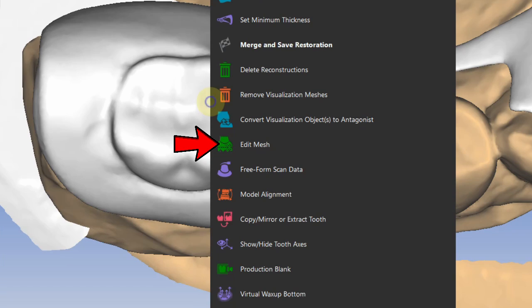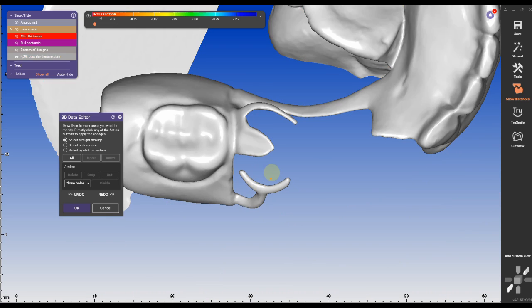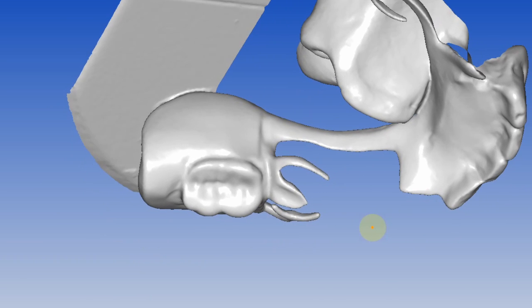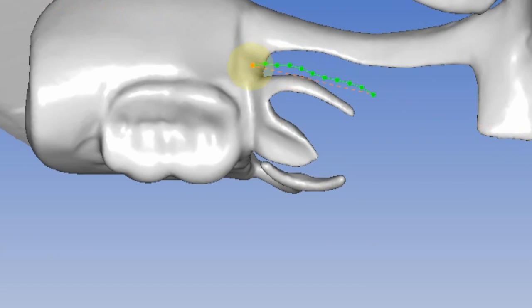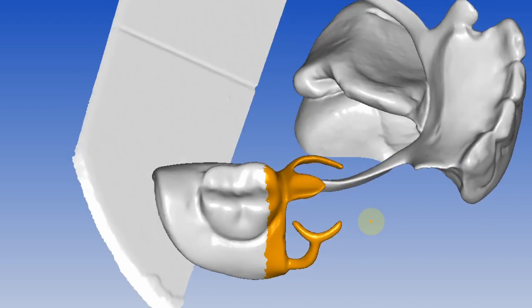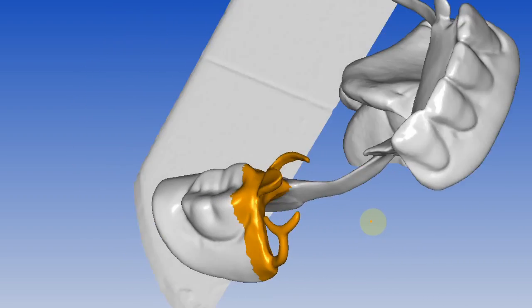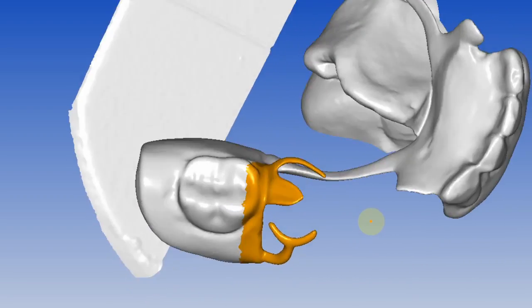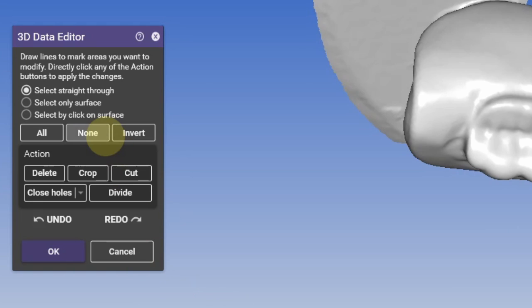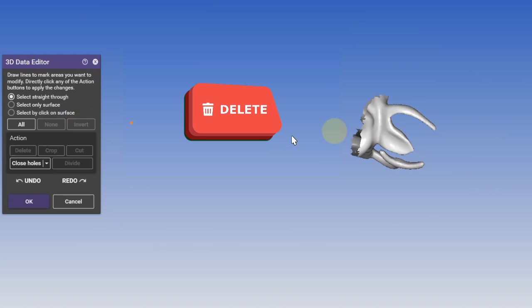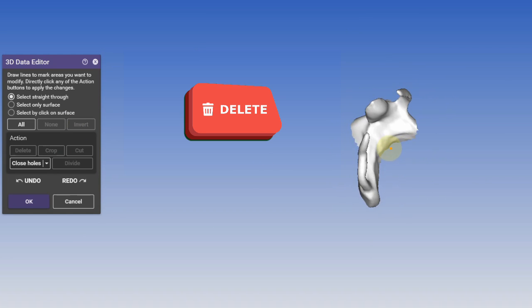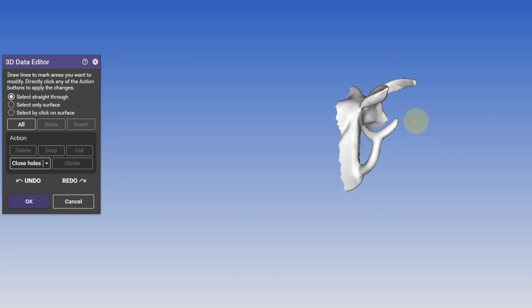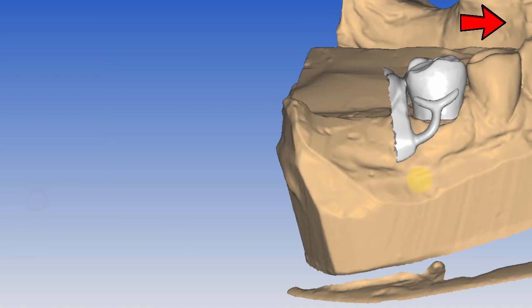Then I'm right clicking on the partial scan and select edit mesh. Position the partial in a way that the major connector is not intersecting with the clasp and selecting only the clasp and the occlusal rest. Make sure the proximal area is fully selected and there are no holes. Then I'm inverting the selection and clicking delete so only the clasp and the occlusal rest of the partial remain in the scan.